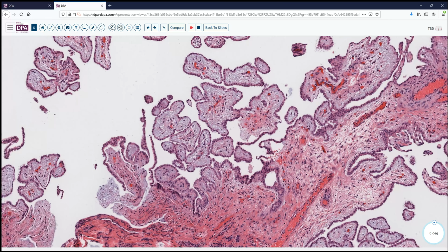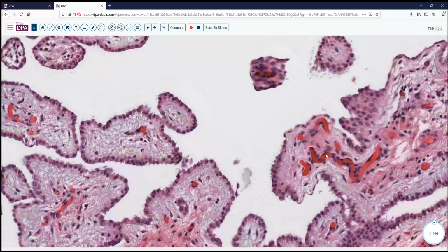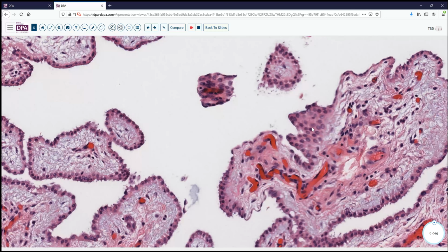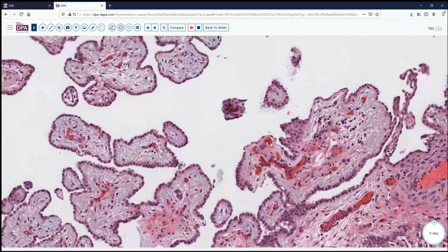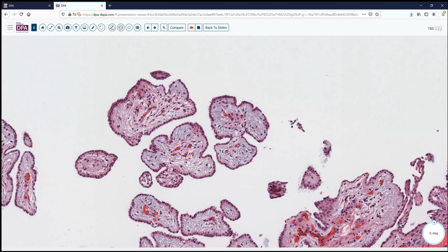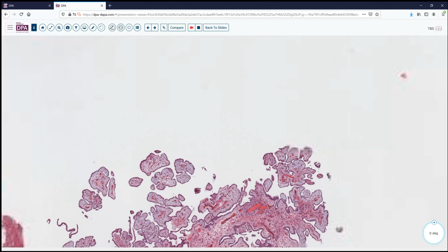We don't see much in the way of anything that looks like endometrial type stroma here, but rather we see these myxoid stromal areas of papillarity surrounded by a very nice low cuboidal, bland, chain-like epithelium. Occasionally bunching up here in a few areas, but the nuclei and the nuclear features are very bland, no nucleoli even, no mitotic figures, no karyorrhexis, and so forth in that fragment.